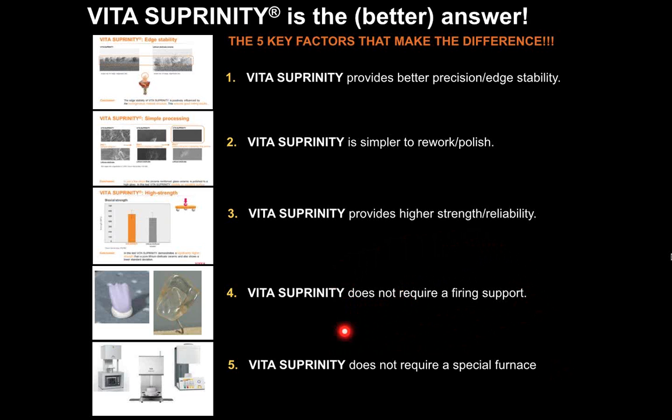And you don't need any special furnace. You can use any conventional furnace. So these are a few of the points.